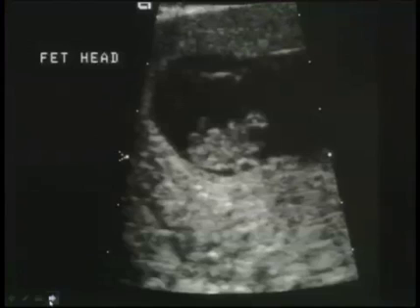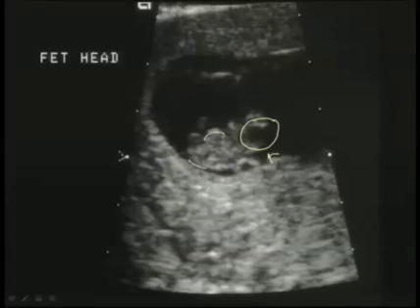Here's an example of the developing embryonic brain, the rhombencephalon. Notice how in this area here, it looks as though the embryo has a defect in the head. This is the area of the head. This, of course, is the body here. And then there's this apparent large defect. That is the normal developing embryonic brain and should not be mistaken for pathology.